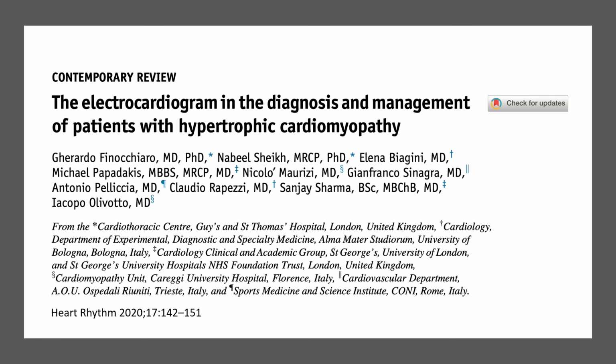In this interesting and detailed review, the authors discuss the current role of the ECG in the diagnosis, risk stratification, and management of patients with hypertrophic cardiomyopathy.